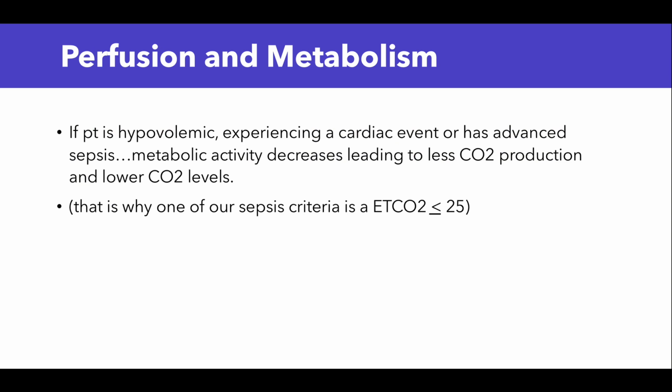How is Capno related to perfusion and metabolism? Well, if a patient is hypovolemic, experiencing a cardiac event, or has advanced sepsis, metabolic activity decreases, leading to less CO2 production and lower CO2 levels. That's why one of our sepsis criteria is an EtCO2 reading of less than 25.